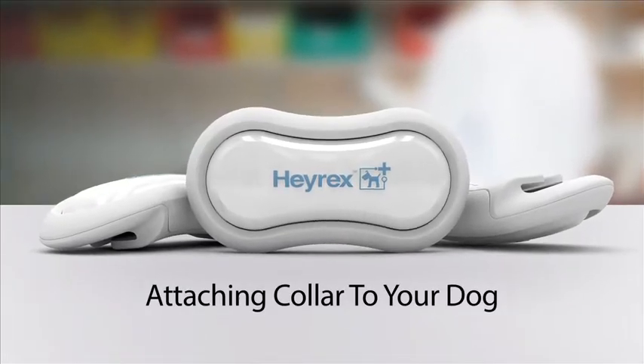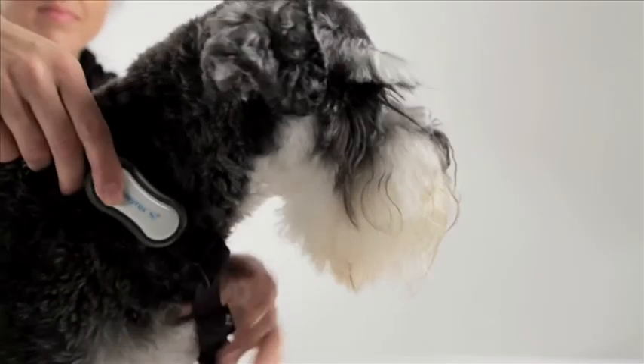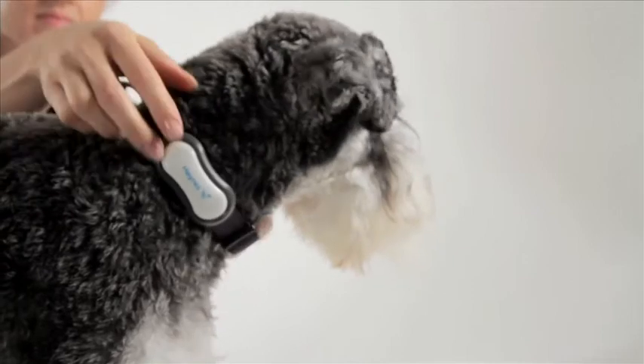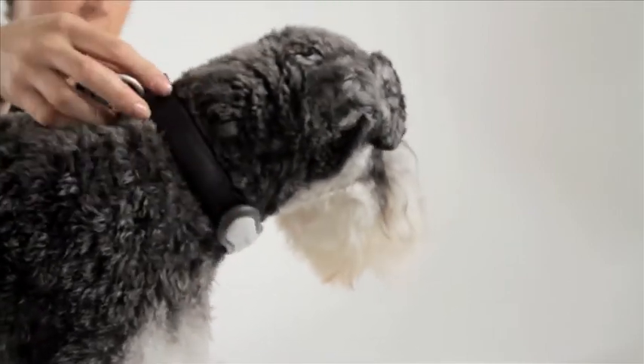To attach the collar to your dog, position the biosensor on the collar so that it will settle under your dog's chin. Ensure that the Hayrex logo is facing up the correct way. Ensure the biosensor sits under your dog's chin like this.